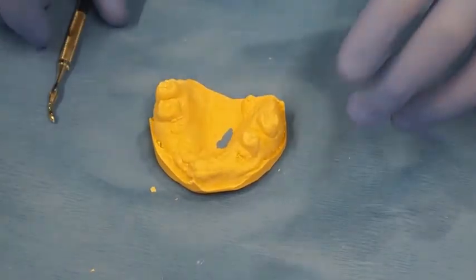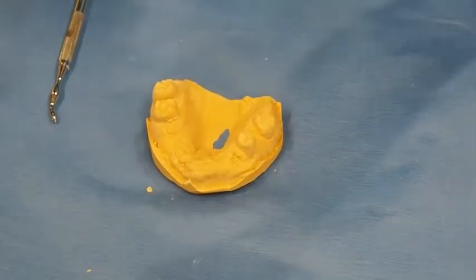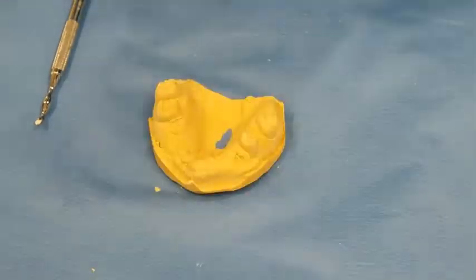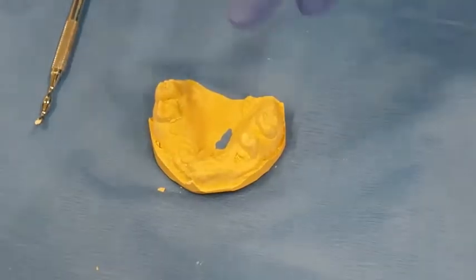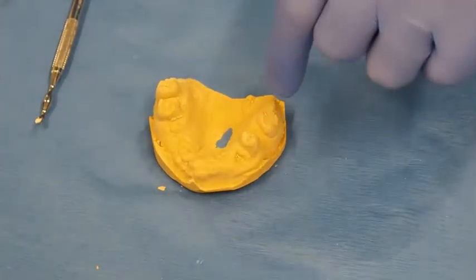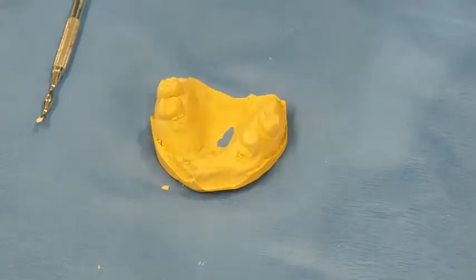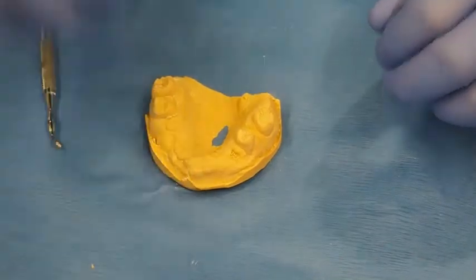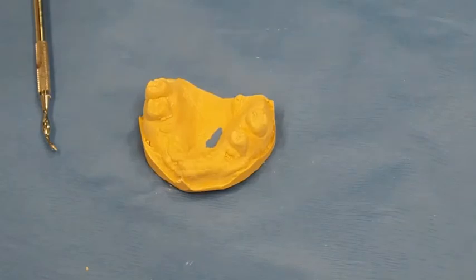Well, I need to fabricate that denture with these teeth in. So what an immediate denture means is we have to do the custom tray, we have to do border molding, we have to do the final impression, we have to extract the teeth on the cast, set up the teeth, process, and finish before we go to the surgery day. And of course, we mount the cast on an articulator. Exactly. So we can do the occlusion correctly. Of course, I mean, there's no doubt about that.